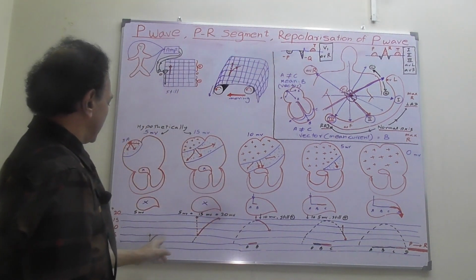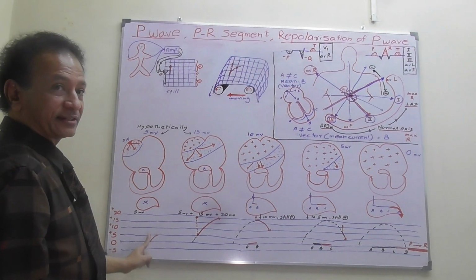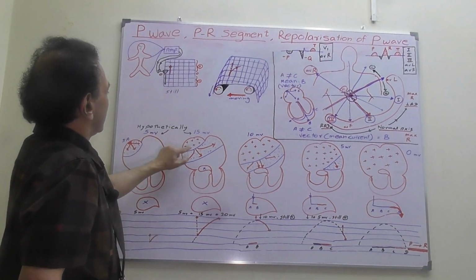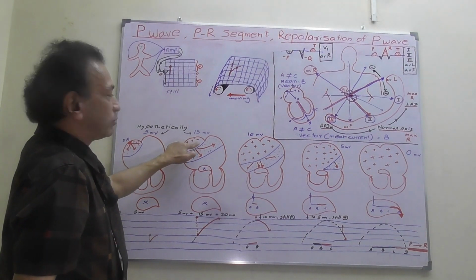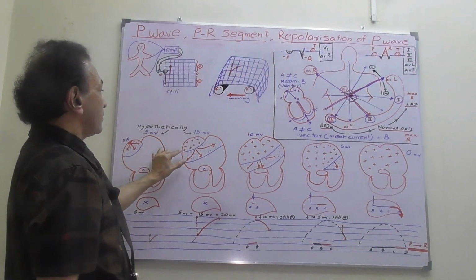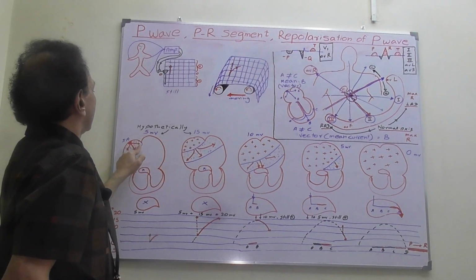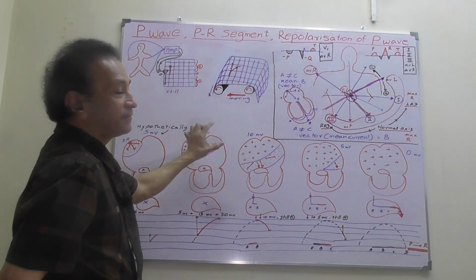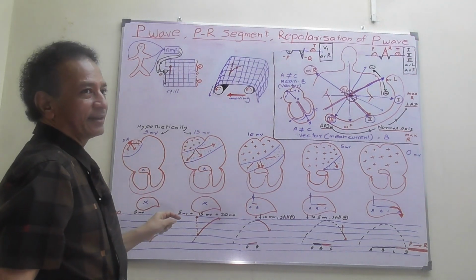So in ECG, you get a curved wave instead of the straight upward wave. Now the next section, this area has already contracted, so all the negative ions became positive. So now this part is positively polarized. Now that current spreads towards the other section. Now instead of the right atrium, it spreads to the left atrium as well. So now a huge amount of atria is getting contracted.